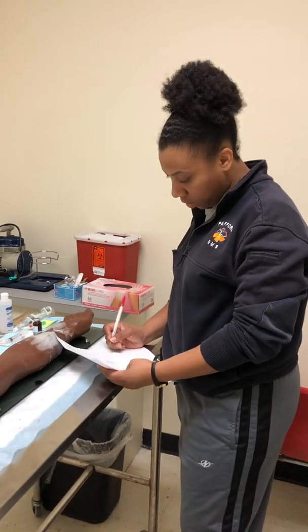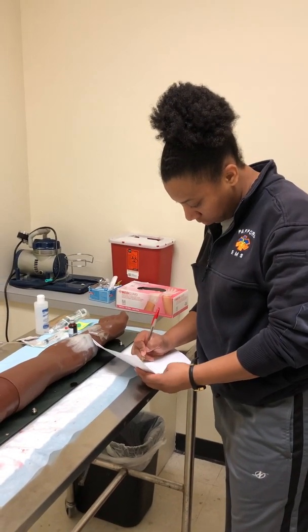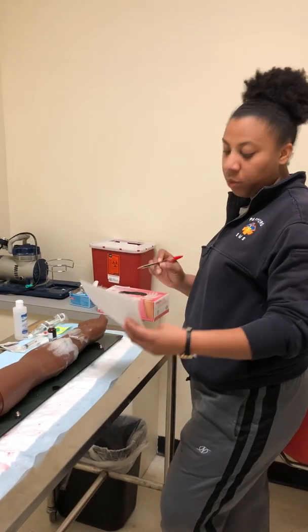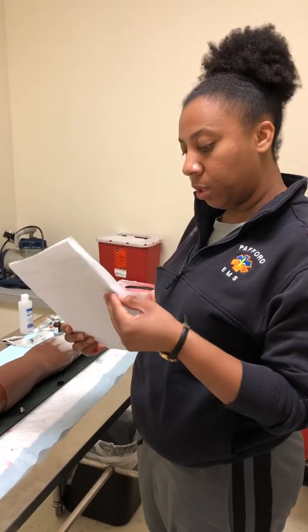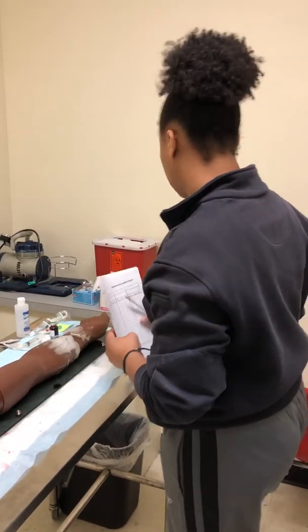We're going to use a, let's see. So she should be receiving 4 milliliters, and that's going to be infused over 1 to 2 minutes. So make sure we do 4 milliliters. That's how much she'll be getting.